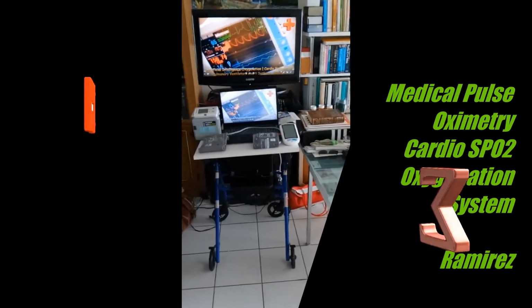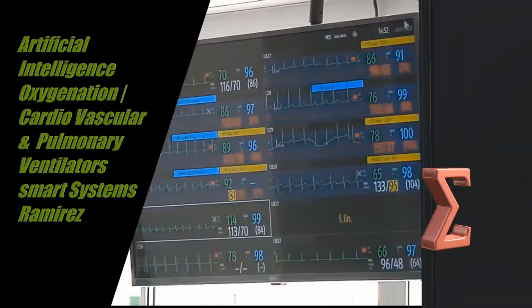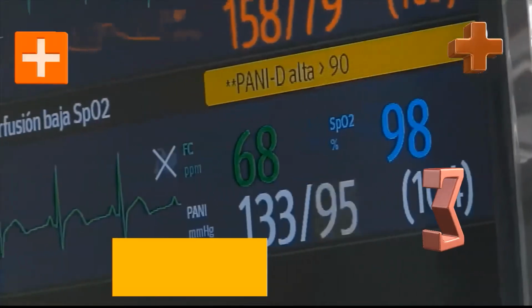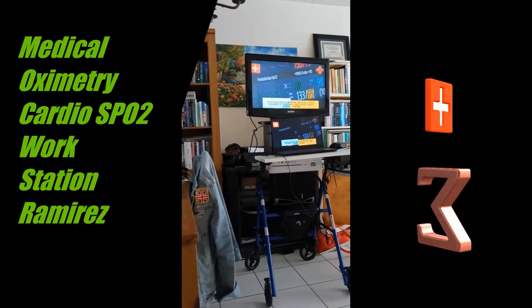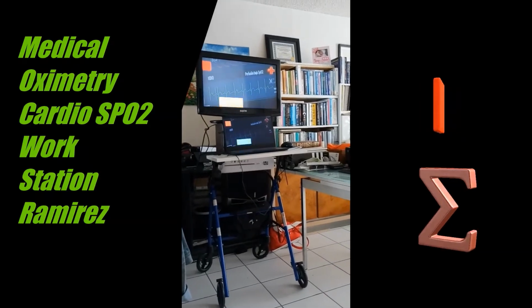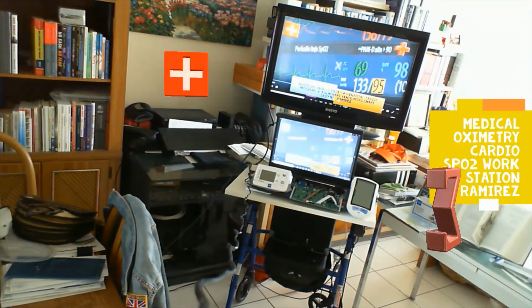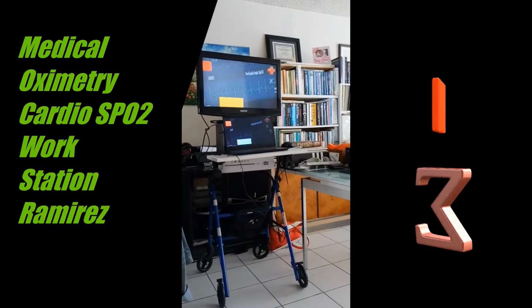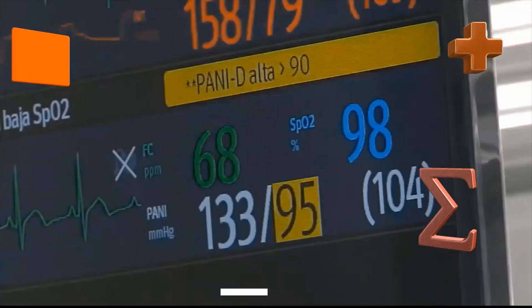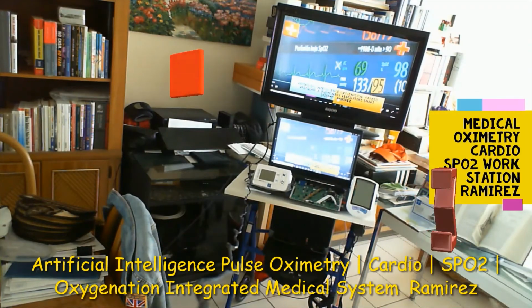The software models were developed with Python and C++ algorithms and augmented with the implementation of a digital arterial pressure unit, including SpO2 for pulse and blood oxygenation measurements, as well as a pulmonary ventilator system. These elements comprise the artificial intelligent medical integrated system.